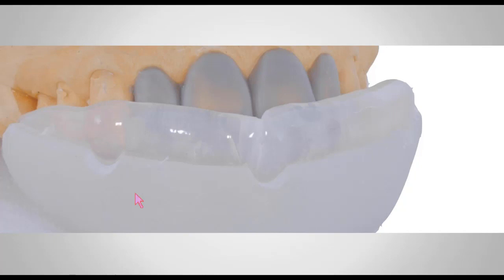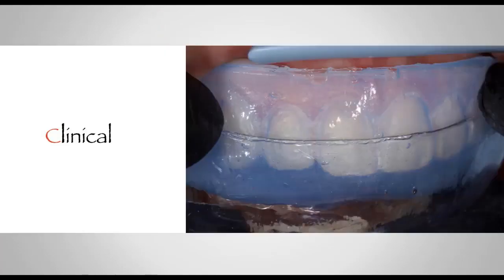Once you're done, and again, this is the same case that I've been working on from the beginning, there's my wax up. There is the polymerized, or set, clear PVS. And here's my clear triad right outside, serving as a shell on top of my clear PVS. So once you have that, you're ready. You're done with the lab portion of this.